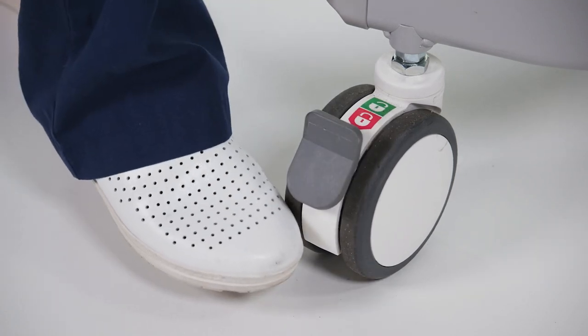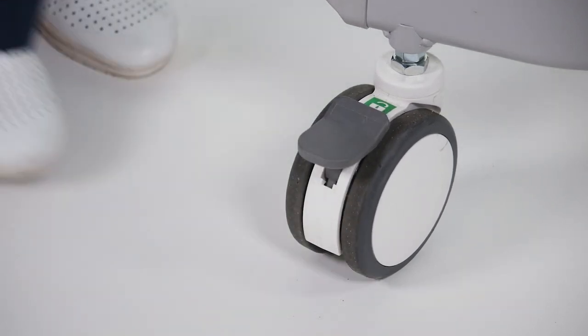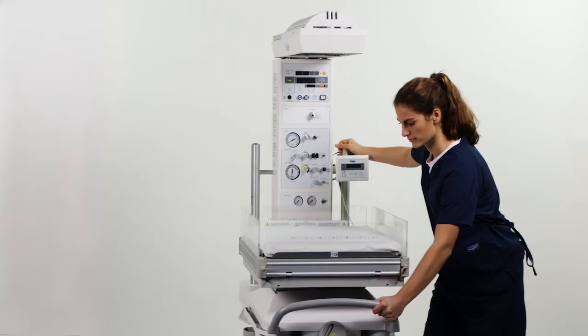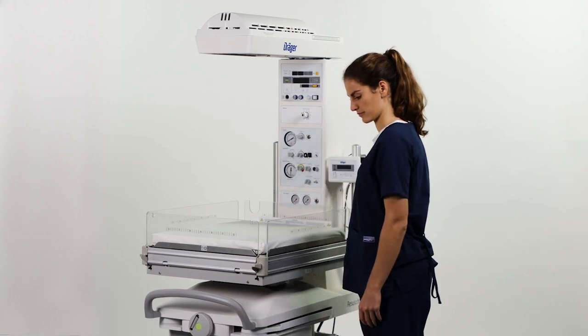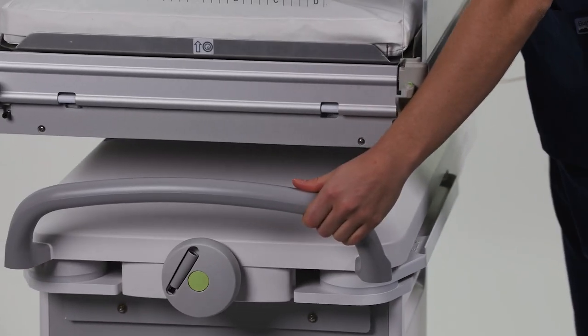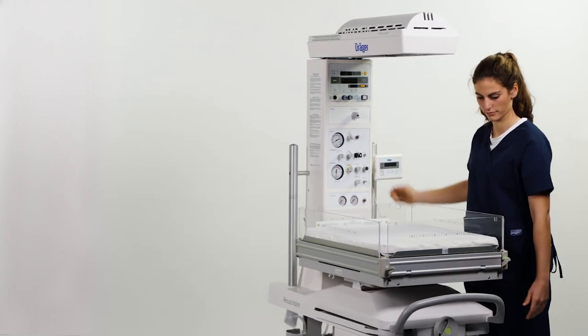Casters are 5-inch dual wheels with steering and locking, making it easy to move the device. The front and rear push and pull handles allow for easy transport of the Resuscitaire. This eliminates having to pull on the side panels, reducing the likelihood of breaking the outside panels.